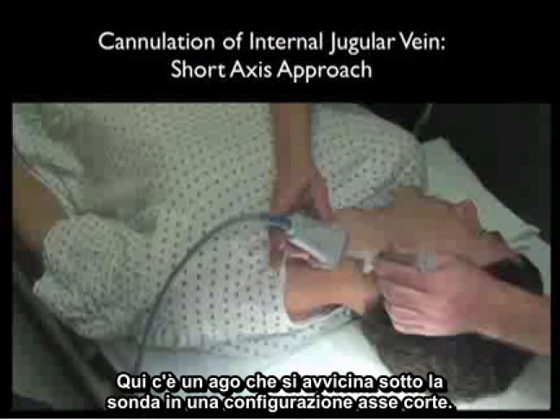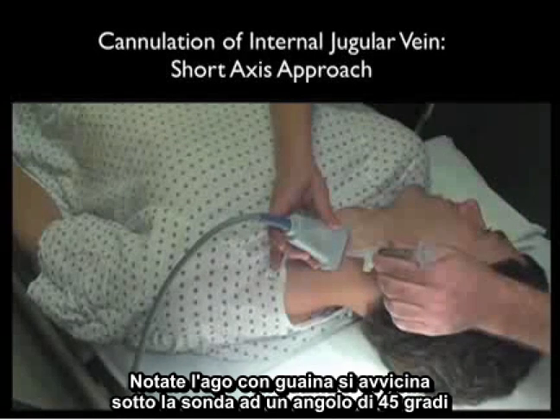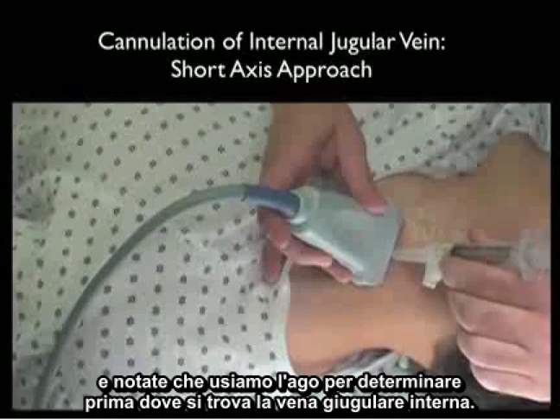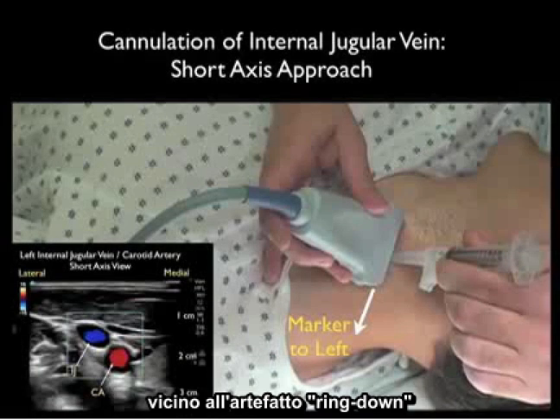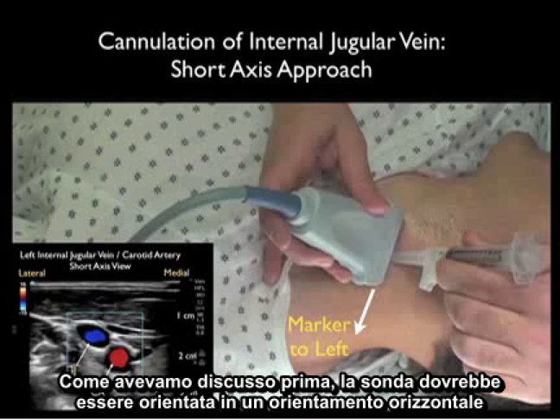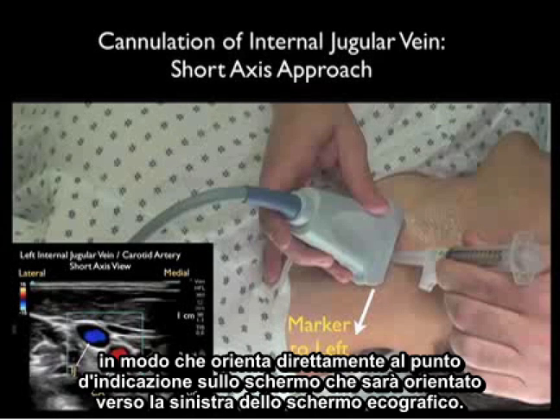Here's the needle coming in underneath the probe in a short axis configuration. Notice that the sheath needle is coming in underneath the probe at a 45-degree angle, and we're using the sheath needle to first determine the location of the internal jugular vein by the ring-down artifact. We would use the same approach for the cannulating needle coming in underneath the probe at a 45-degree angle. The probe should be oriented in a side-to-side orientation with the marker down towards our left as we stand at the head of the bed, so it orients directly to the screen indicator dot which will be oriented towards the left of the ultrasound screen.